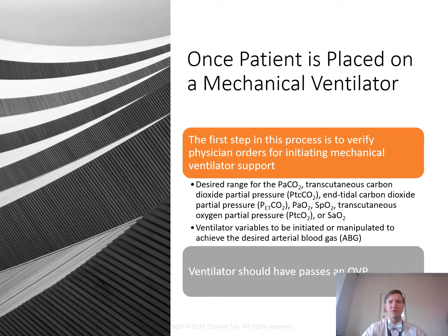So when we're looking at these observations, the breath sounds, the work of breathing, level of consciousness, plus the information provided from the ventilator, and the hemodynamic monitoring, we're going to look at these things when the patient's undergoing mechanical ventilation. It's going to give us a whole big picture. It's going to give us lots of important information.